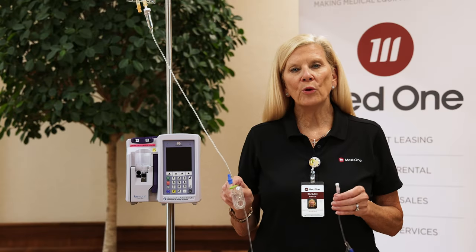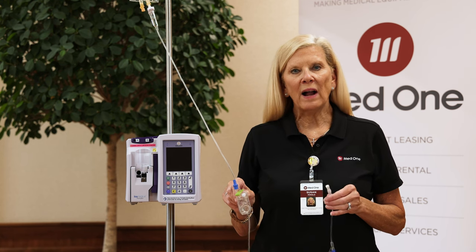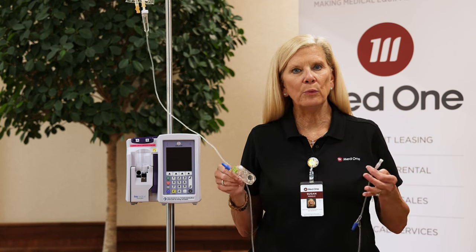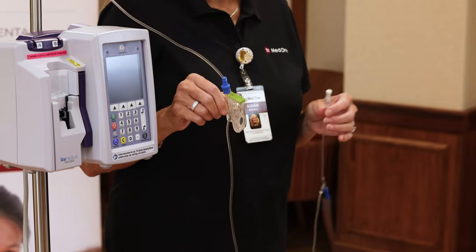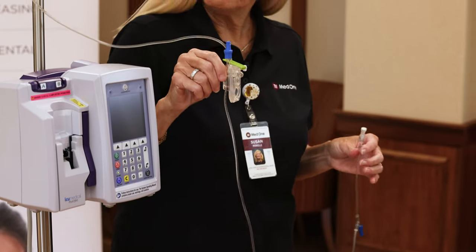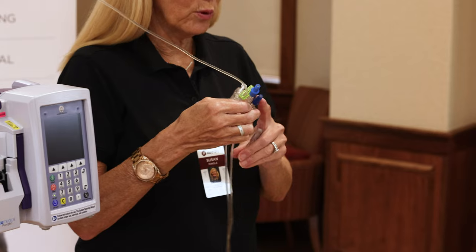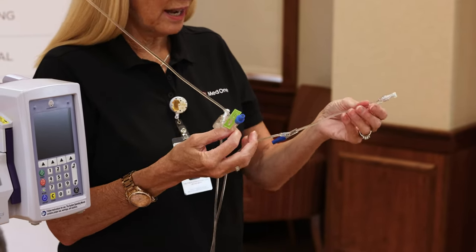We're going to move into the tubing portion of the demonstration. ICU Medical offers a wide variety of tubing choices — blood sets, pump sets, one, two, or three ports, filter sets. Today's demonstration uses a pump set that has one port. Their needle-free ports are called claves, used for any IV pushes closest to the IV insertion site.